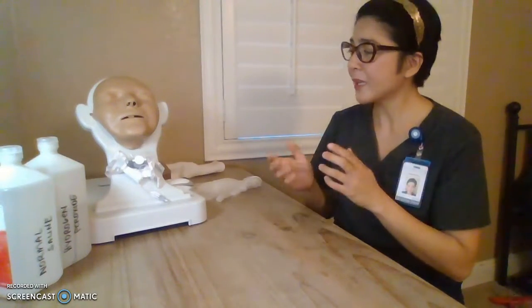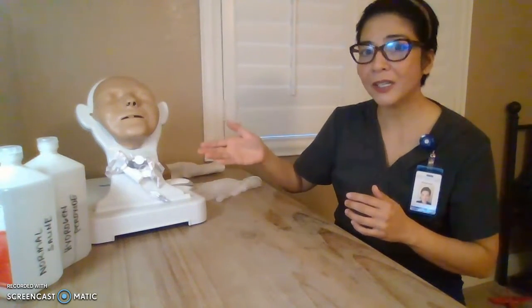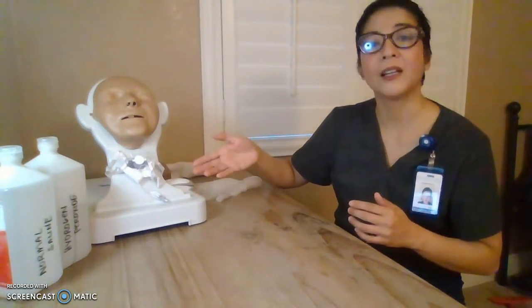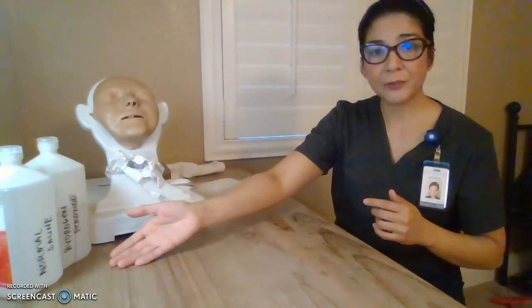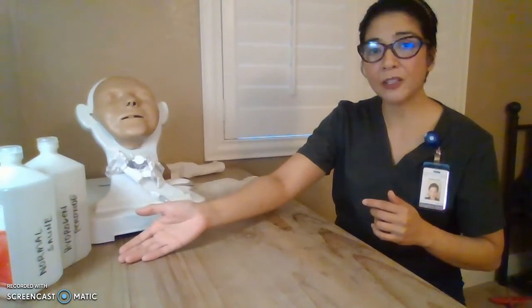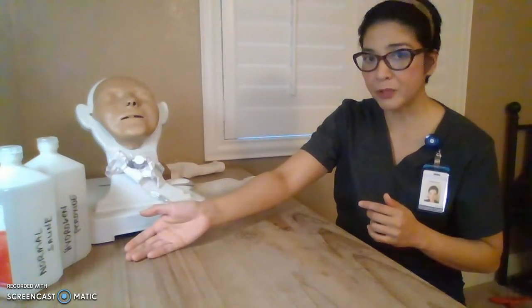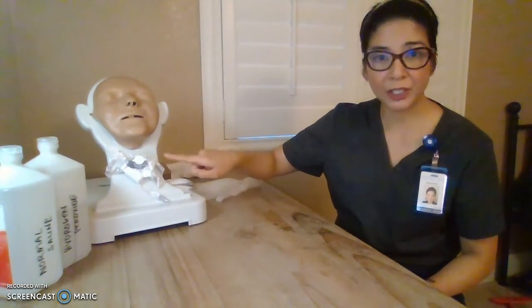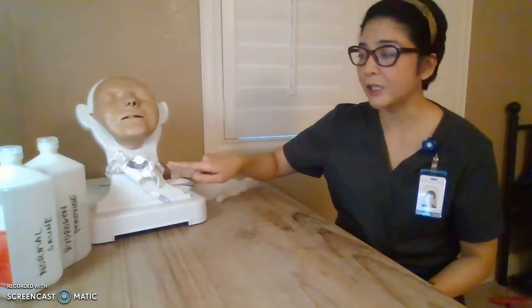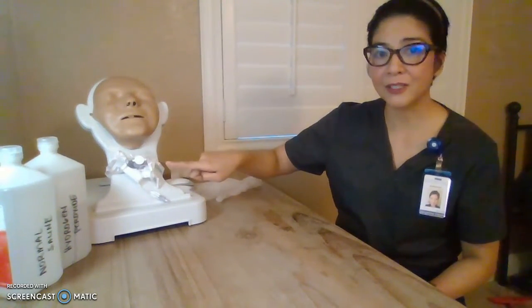All right. And then this is a good time for you to assess your patient as well. How is he breathing? How does he look? How is his skin color? All right. So have a pulse ox with you. Attach it to your patient. Make sure it's on the patient at all times throughout the procedure so you can monitor his vitals. Get your numbers in. Also a good time to assess your stoma site. Is there any drainage? Document on it. How about the placement of the trach? Okay, document on that as well.